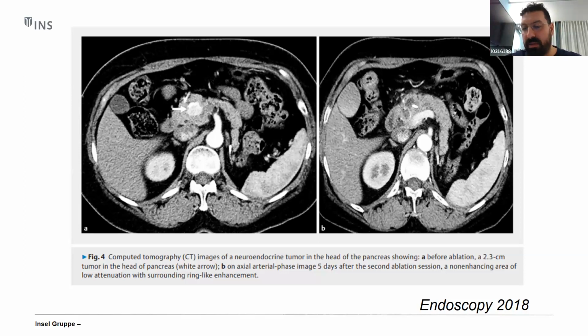Warum sollte man die Zyste vor der RFA entleeren? Es geht, wie wir mit Anja diskutiert haben, darum, die Umgebungsstrukturen zu schützen. Wenn man Hitze in Flüssigkeit appliziert, kann es sein, so weit ich gelesen habe und wie die Autoren in den kleinen Serien beschreiben, dass die in Flüssigkeit applizierte Hitze einen größeren und weniger kontrollierten Hitzeschaden in den Umgebungsstrukturen macht.